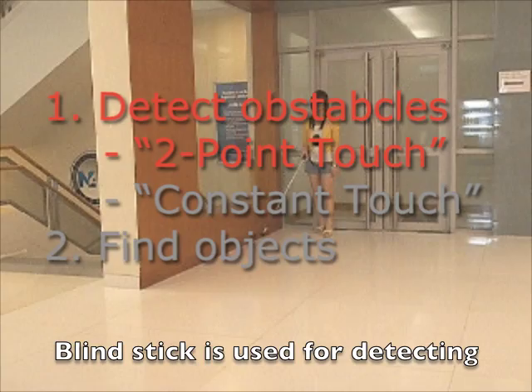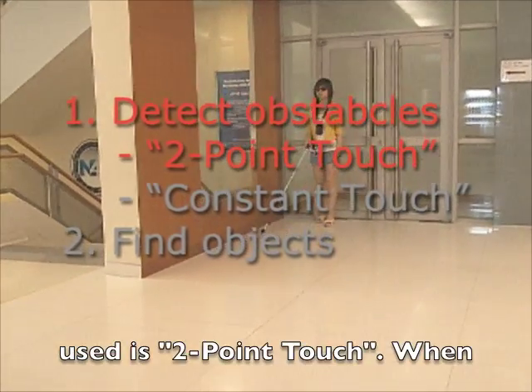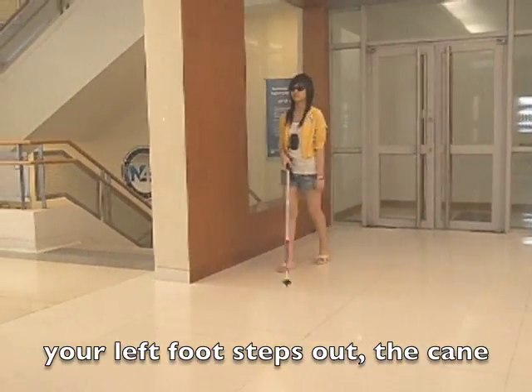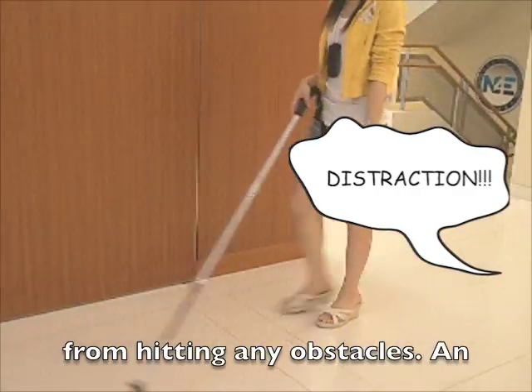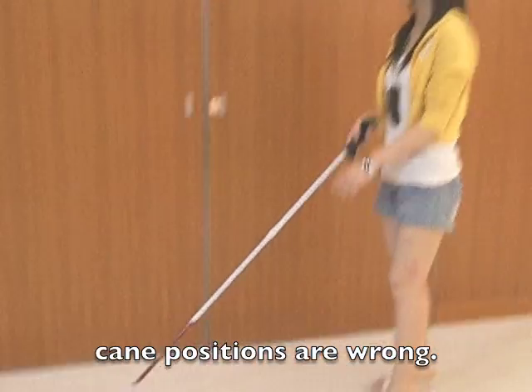The blind stick is used for detecting obstacles. One of the techniques is two-point touch: when your left foot steps out, the cane should go to the right, and vice versa. This is to protect yourself from hitting any obstacles. An alarm will ring if the steps and cane positions are wrong.